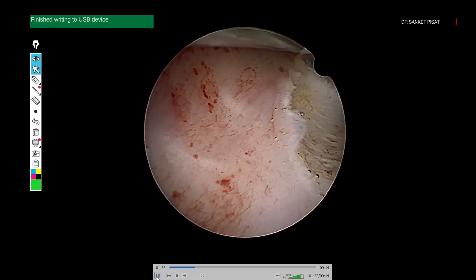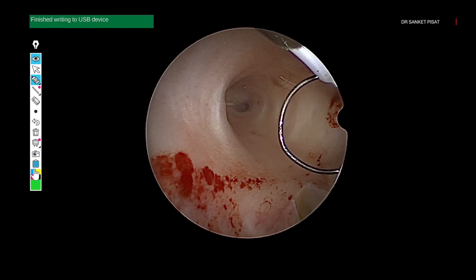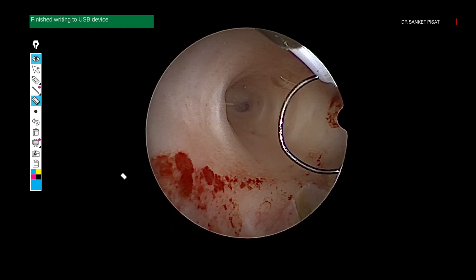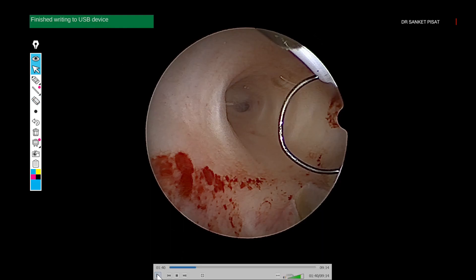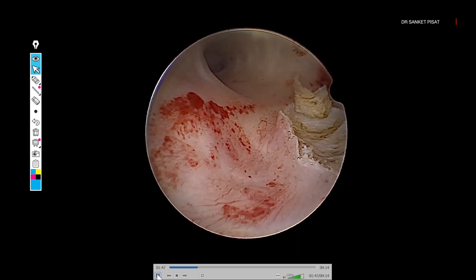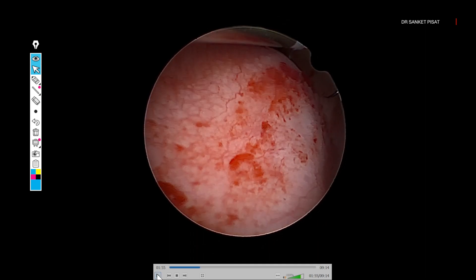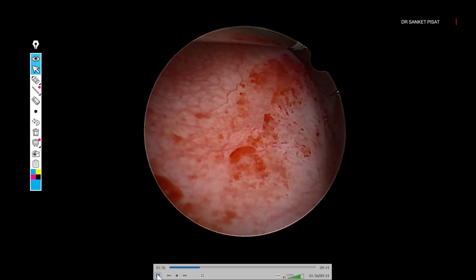After shaving the base of the polyp, when I go to the area where the fibroid was located, there is absolutely no fibroid seen. We had seen a fibroid located right over here, but there is nothing now. This is a common problem when people start doing the surgery — the ultrasound reported something, but nothing can be seen. The problem is high intrauterine distension pressure, which is not allowing the fibroid to bulge. Simply reduce the distension pressure — on the hysteromat or by stopping it for some time — and you can see the same fibroid bulges inside completely. Make it a practice to work at low distension pressure to minimize fluid overload and to see pathologies clearly.